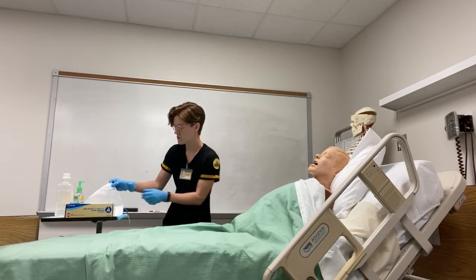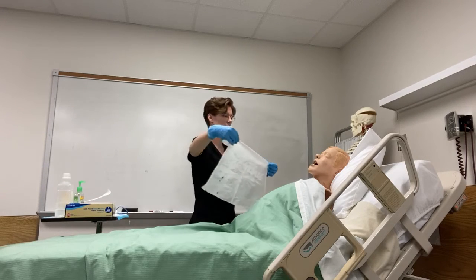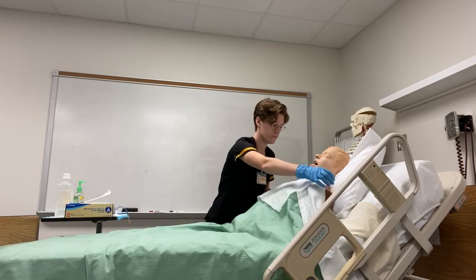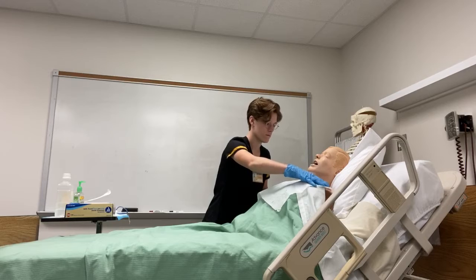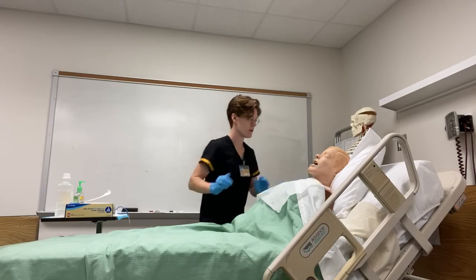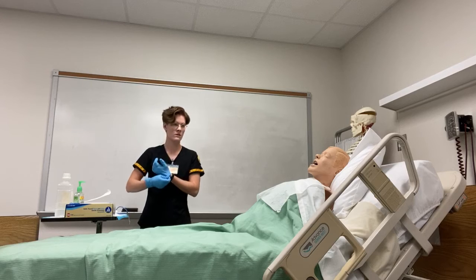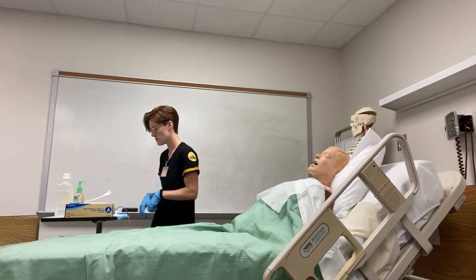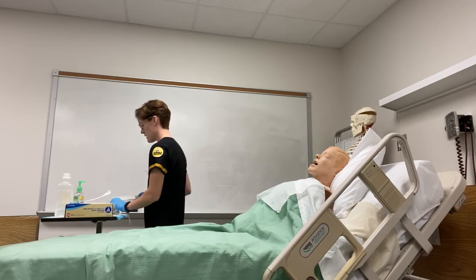So next, I'm just going to drape the patient with this cloth. It's going to catch anything if anything does come up or anything falls on it. So now the patient is in the correct position. So now I'm just going to go ahead and I'm going to get my tube ready. I'm going to make sure that the tube does not touch anything else.